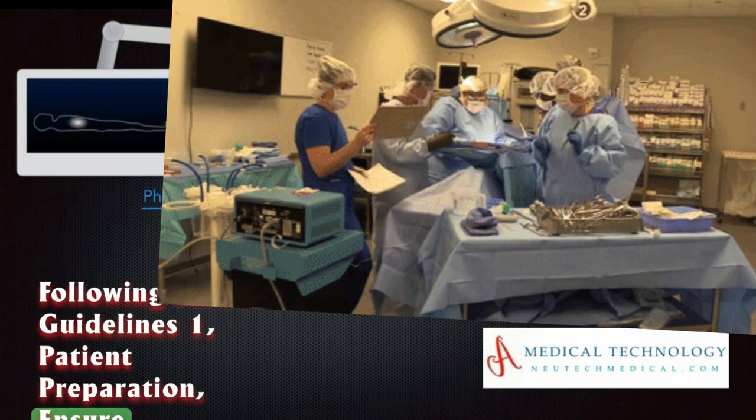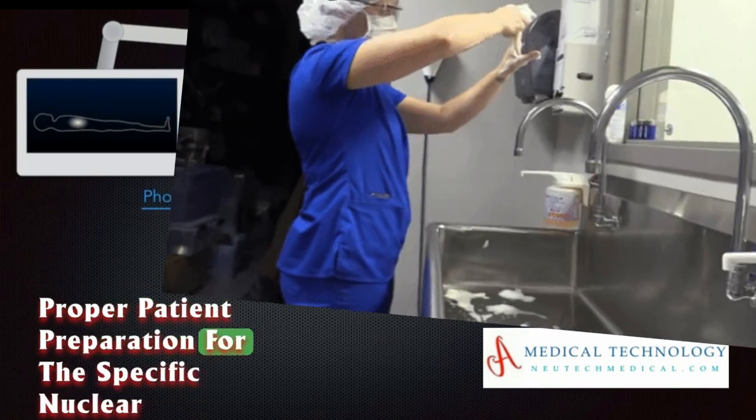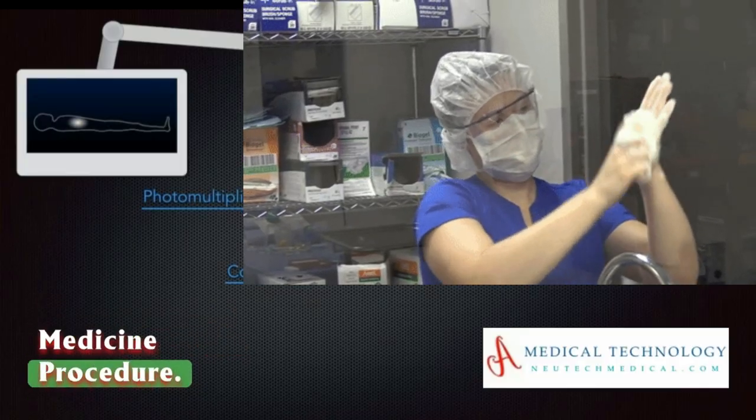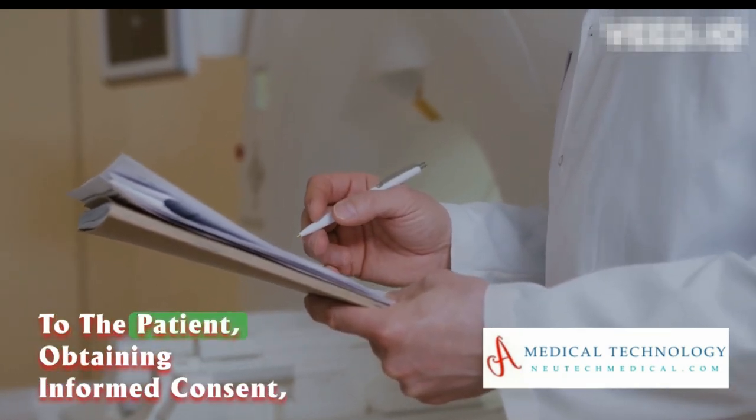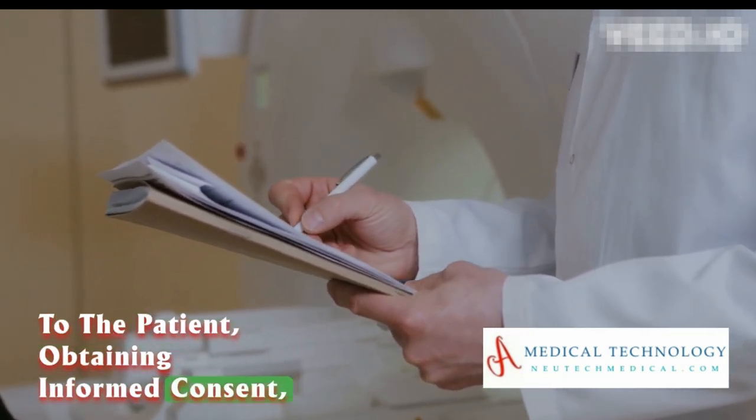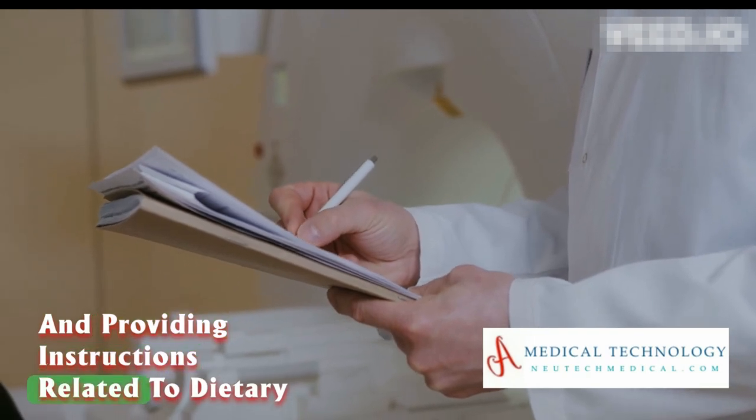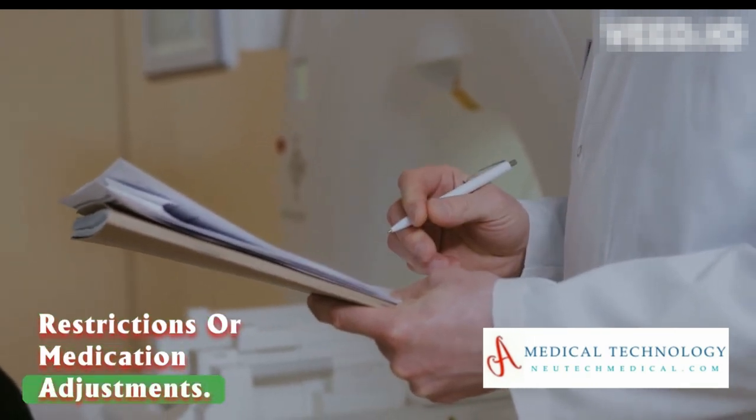Patient preparation: Ensure proper patient preparation for the specific nuclear medicine procedure. This may involve explaining the procedure to the patient, obtaining informed consent, and providing instructions related to dietary restrictions or medication adjustments.